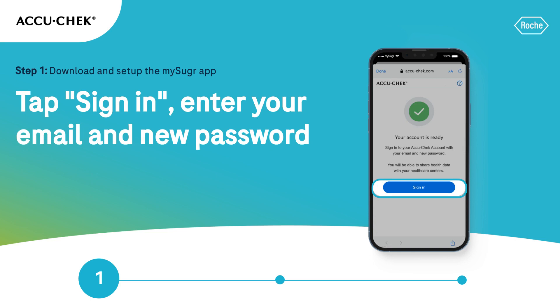If you look at your mobile phone's display, you will notice that after verifying your email address, your account is ready. Tap Sign In and enter your email and new password.